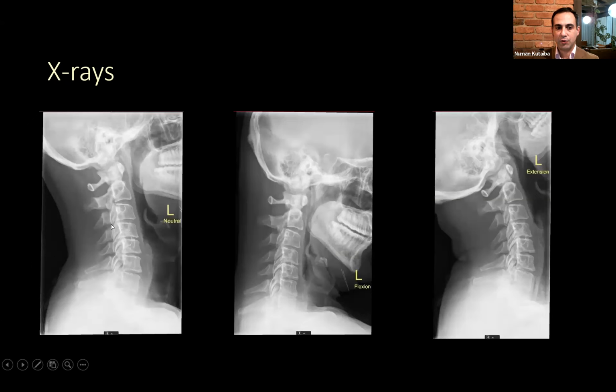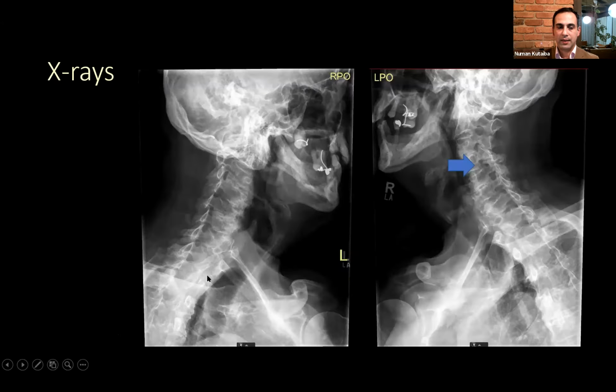These are some new cervical spine X-rays in a neutral position, flexion and extension. These are normal X-rays for this patient. These are done to see if any of the vertebrae will slip, or for example, when there's C1-C2 articulation degeneration, such as in rheumatoid arthritis.